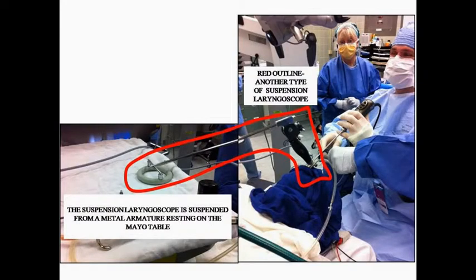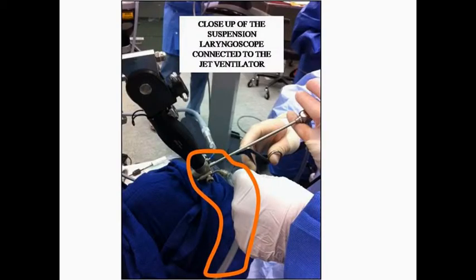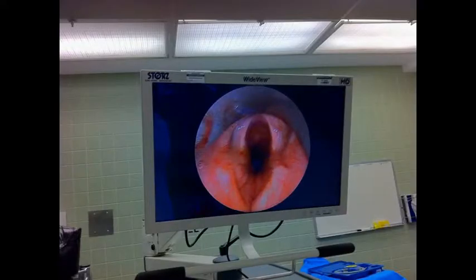Here is an image of the surgeon using the suspension laryngoscope. It is supported by a metal arm placed on the Mayo table and holds the suspension laryngoscope in place so the surgeon has his hands free. You see an image of the glottic opening, and this image confirms that the suspension laryngoscope and the trachea are exactly collinear, and now the suspension laryngoscope is safe for use for ventilating the patient.